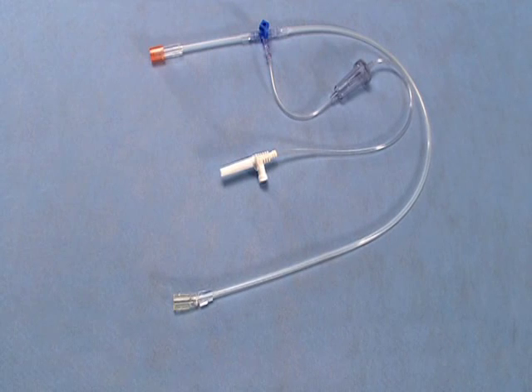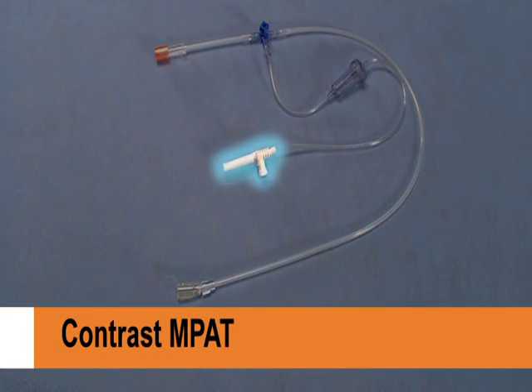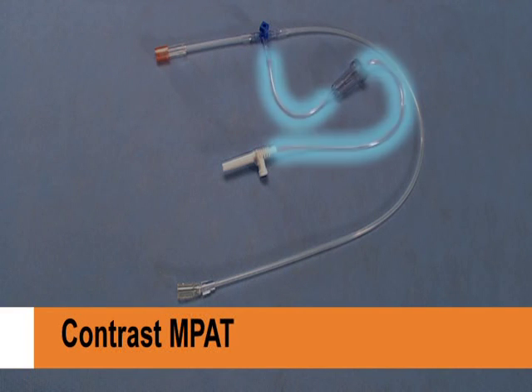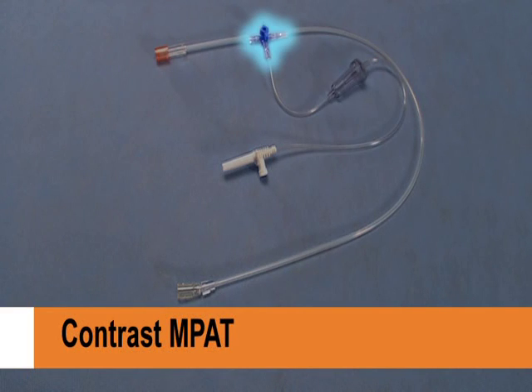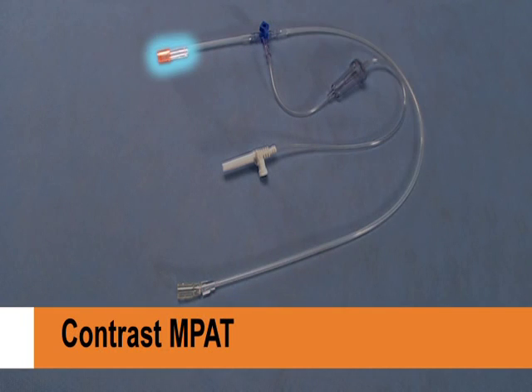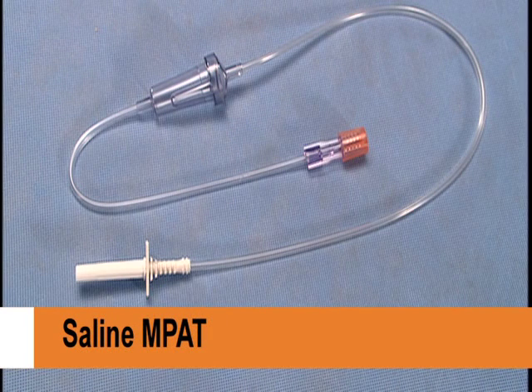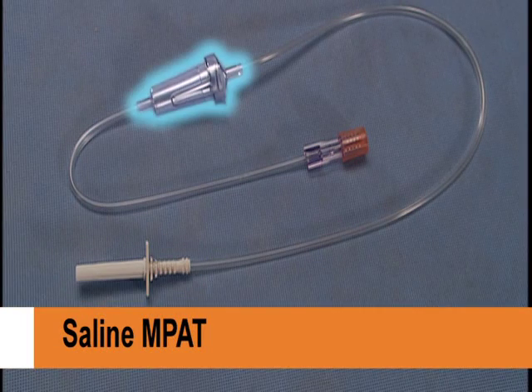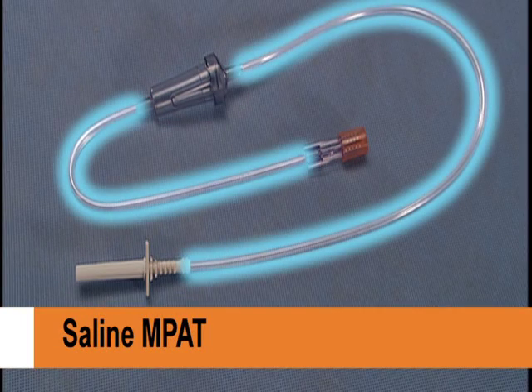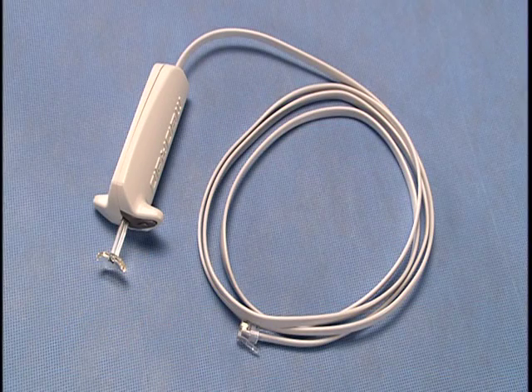The MPAT disposable set for the contrast component includes the vented contrast spike, low-pressure contrast tube, drip chamber, contrast flow control stopcock, high-pressure contrast tube with male lure connector, and a 150 milliliter multi-patient syringe. The saline MPAT consists of a saline spike, drip chamber, high-pressure check valve, and low-pressure saline tube with female lure connector. The hand controller is used to deliver both contrast and saline.